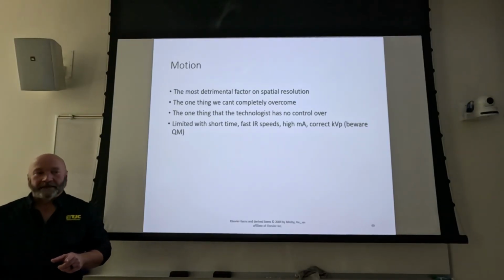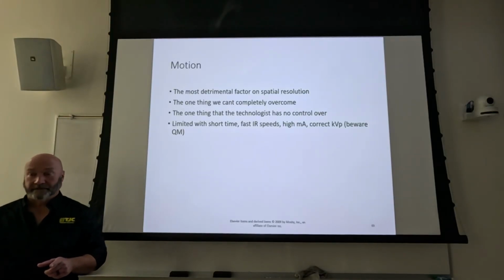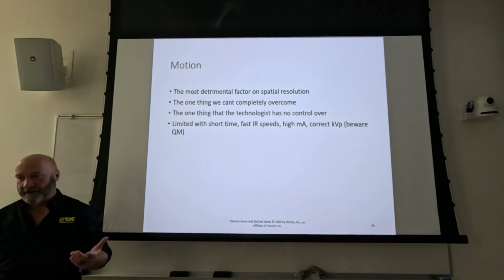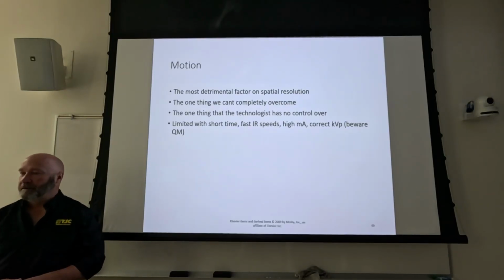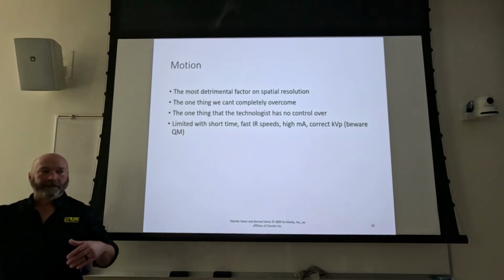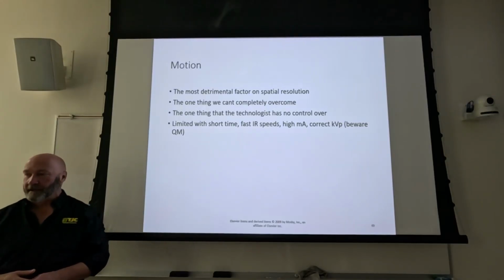So when you set your mAs, actually what you're adjusting is time, right? So if you're shooting portable x-ray on a patient and you need to reduce motion, and the patient can't cooperate, then again you would use the 15% rule: increase your kVp, decrease your overall mAs, and in that case, what you're doing is decreasing your time.